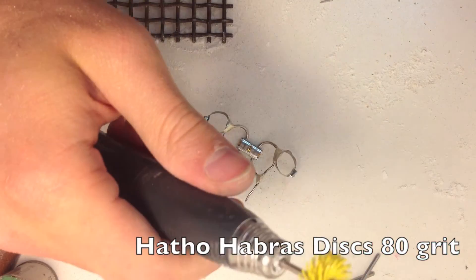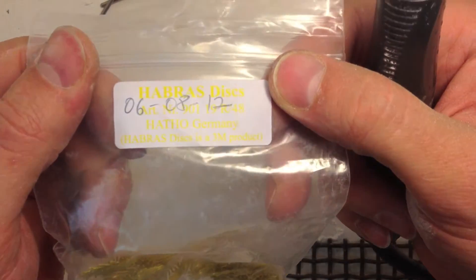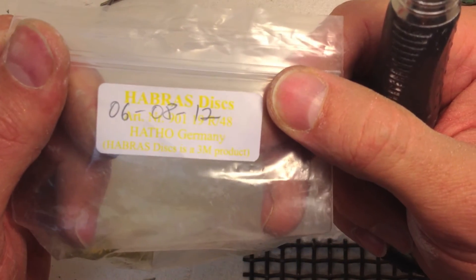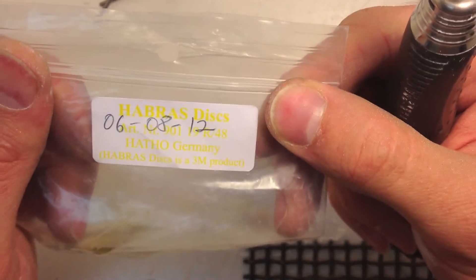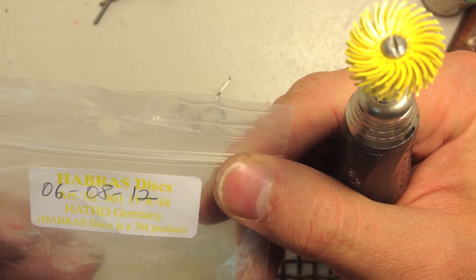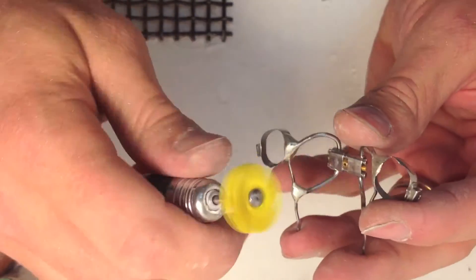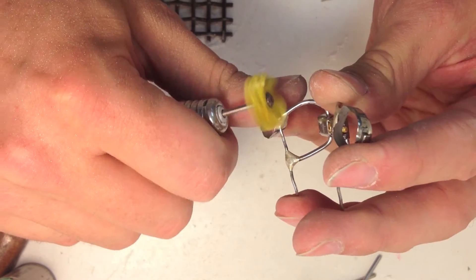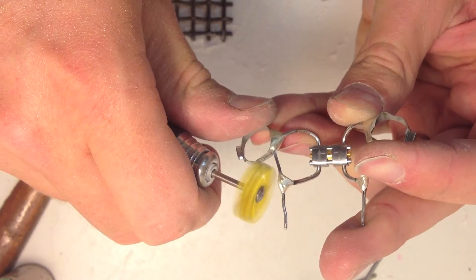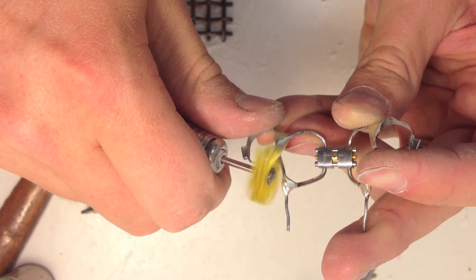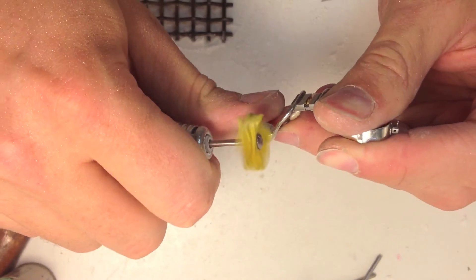The Hatho bristle brushes. I can barely say it. Habrus Disc, that's what it's called, from Hatho Company. This is 80 grit. It's like a pumice. Can you see how the bristles really smooth out the area?